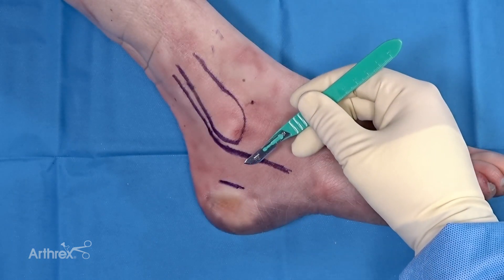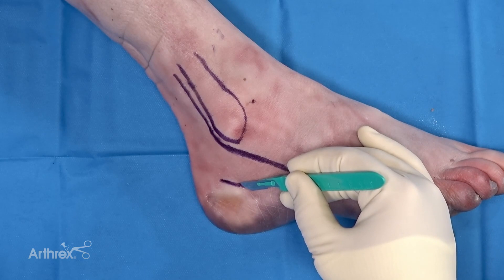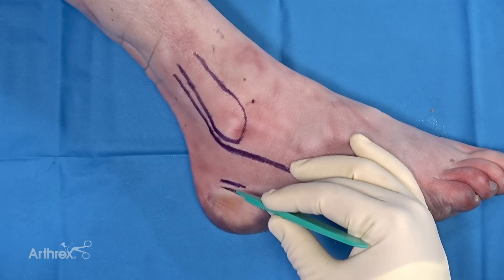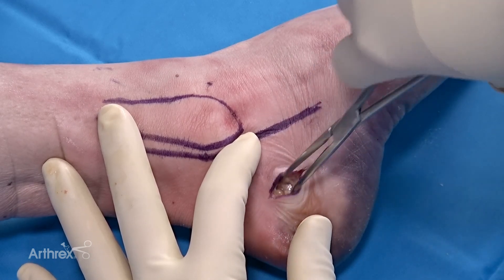The harvester sizes are 6mm, 8mm, and 10mm. Your skin incision will need to be slightly larger than the diameter of the harvester to make sure that you accommodate the harvester itself in the wound. Here we are bluntly dissecting down to the bone of the lateral wall of the calcaneus.